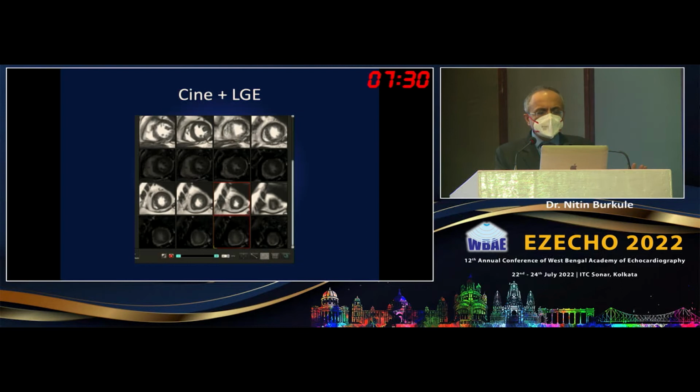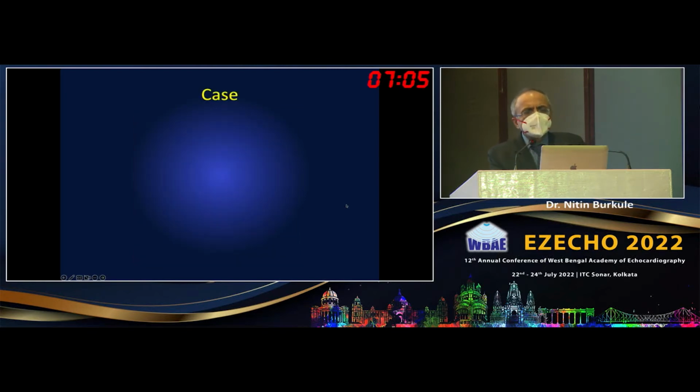edematous tissue. So this is a very classical Takotsubo, where you don't get replacement fibrosis, you get a slight rise in the signal intensity because of the gad in the expanded extracellular volume due to edema, and the T1 and T2 maps show very significant, clear-cut edema at the apex, okay. So you know that this is not an epicardial coronary disease related dysfunction, this is a definite Takotsubo, okay. Let us look at a 16-year-old boy.